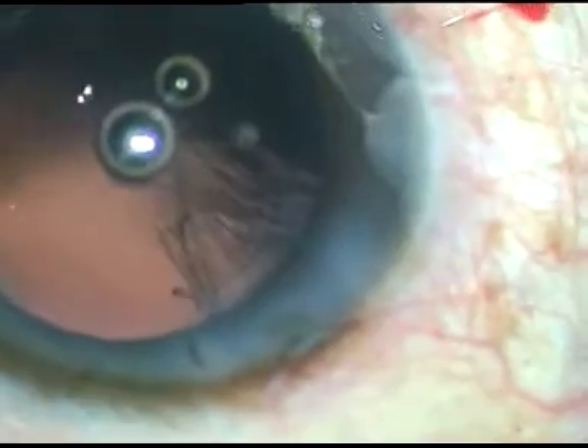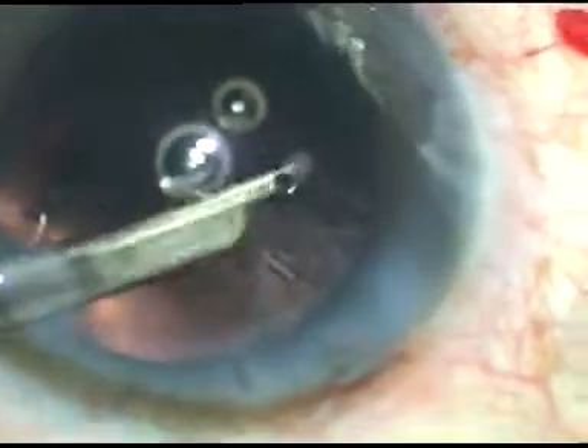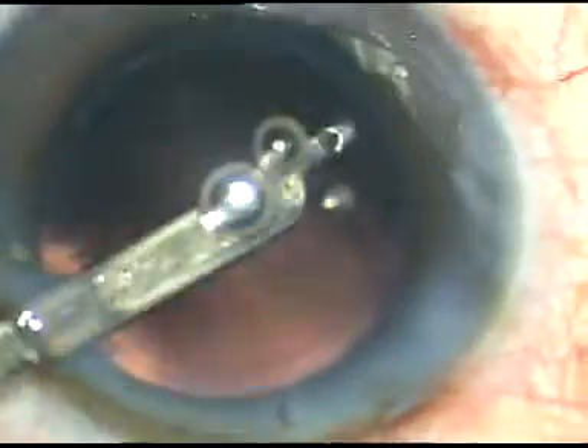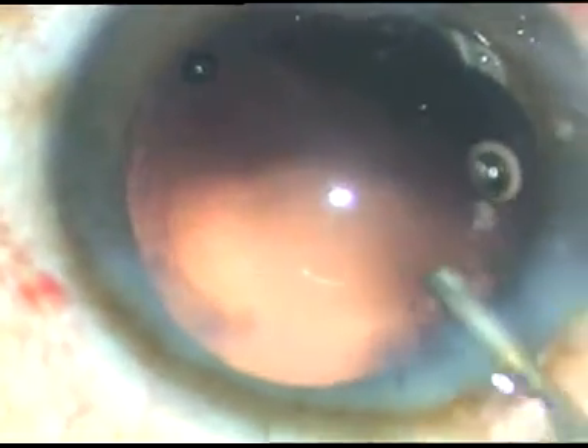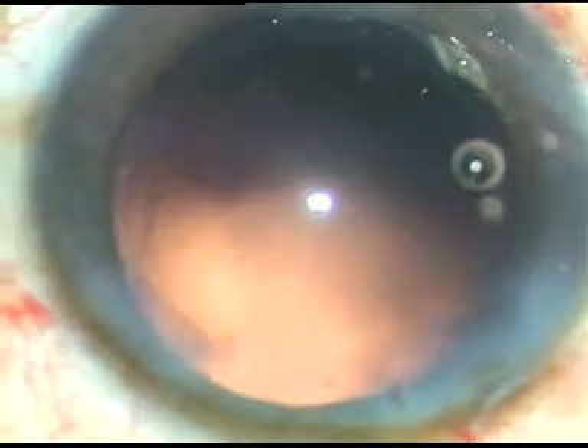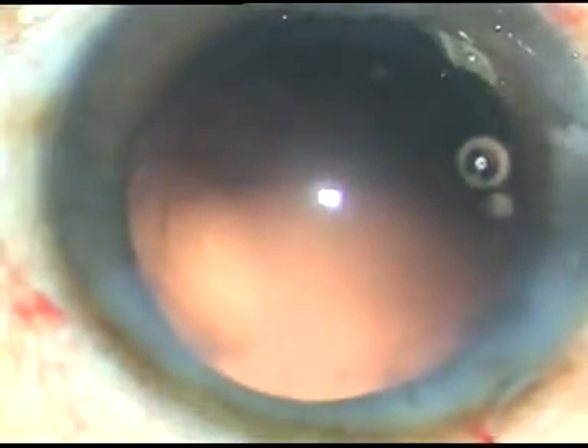This is a very simple instrument. One can also use bimanual irrigation-aspiration. After polishing the posterior capsule, viscoelastic substance has been injected to fill the anterior chamber.